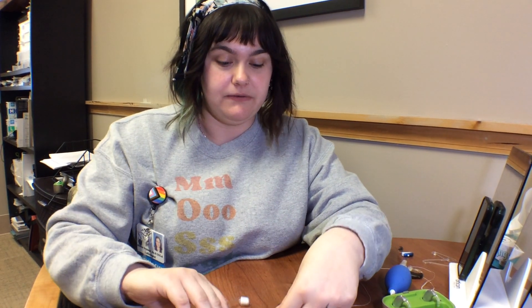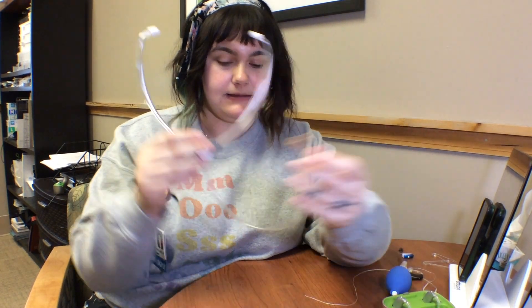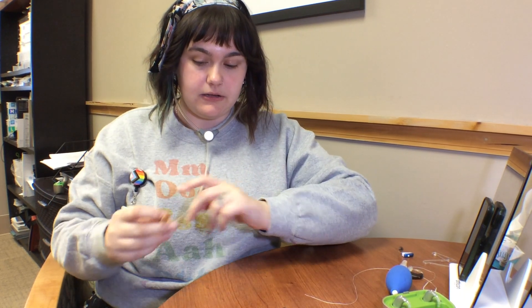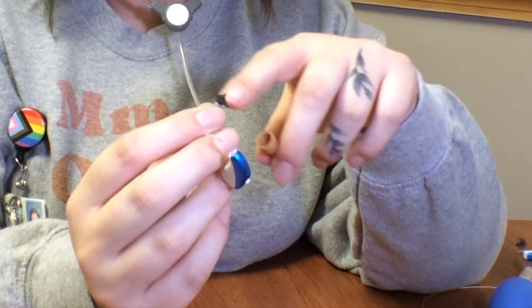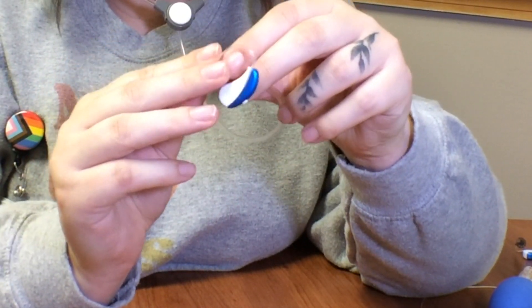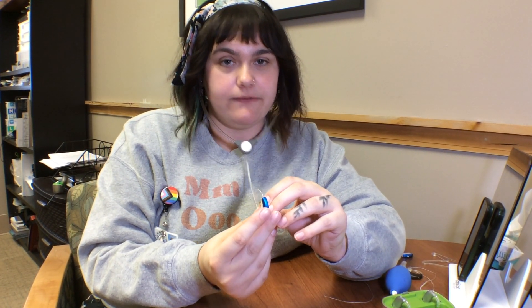The second thing that you're going to want to do is use a listener. Most of them look something like this, and you're going to put the tip of the hearing aid with the dome on down inside your listener.